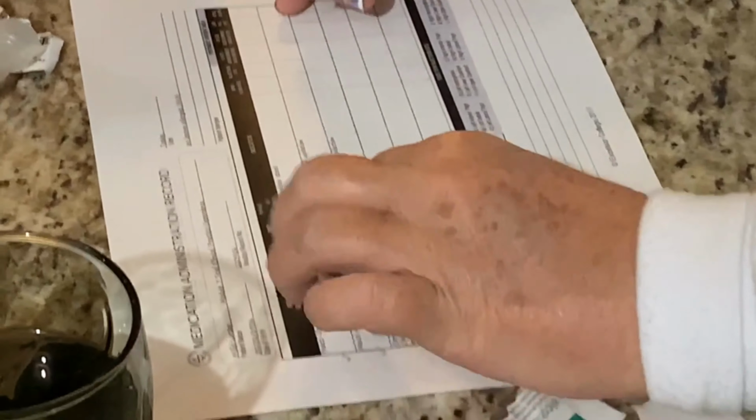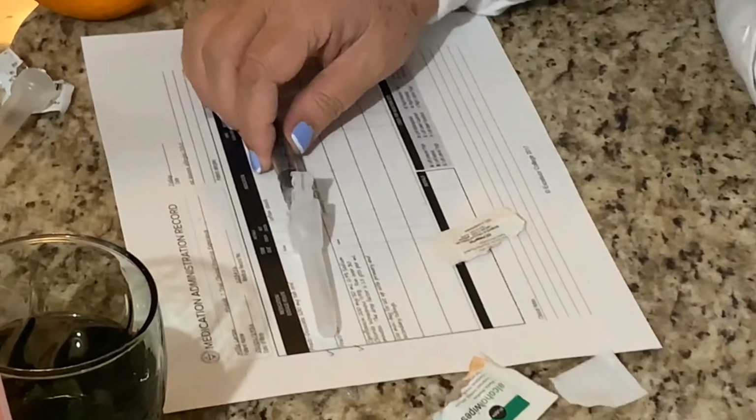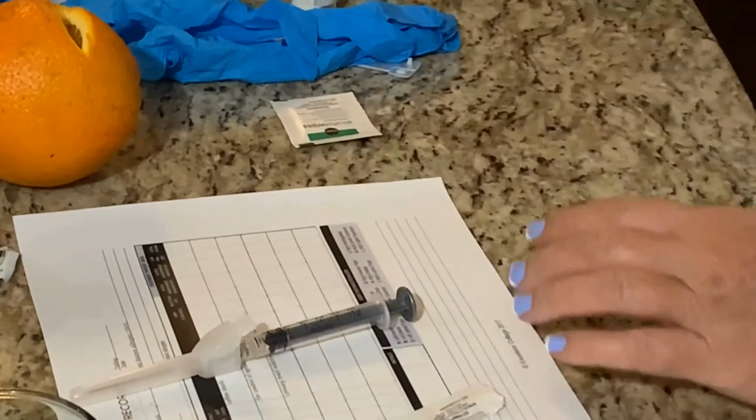Okay, so once I have my medication, then I'm going to do the one-handed scoop. I don't want to pick it up because I could stick myself. So I'm doing a one-handed scoop method. You just put it in the cap, raise it up, and there you go. Now I have to label this. So I've got my tape, or you can use any kind of label you want.